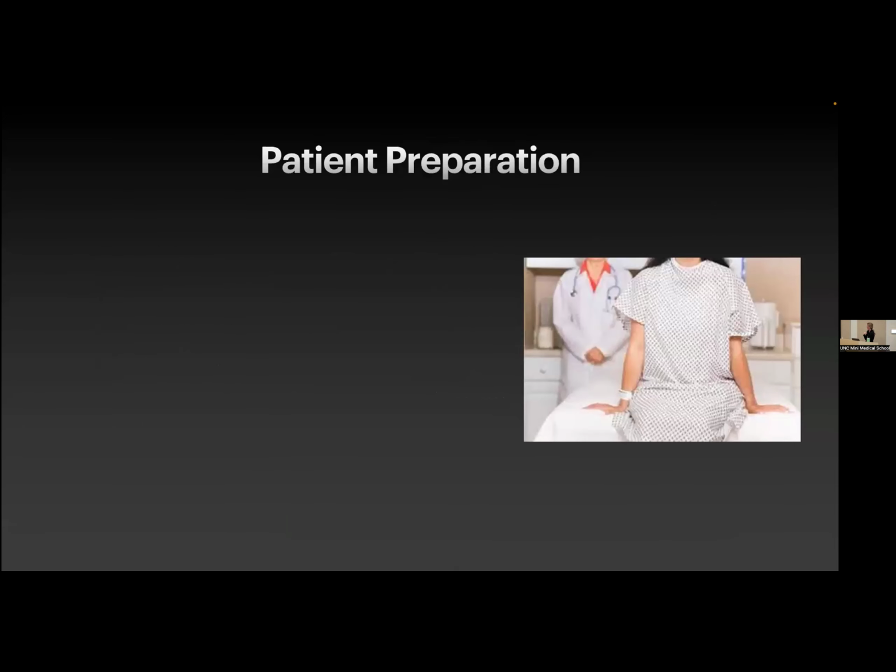So what do you expect as a patient if you're about to get an ultrasound? Well, the good thing is there's really little to no special preparation. There are some scenarios where you might be asked to prepare slightly for this exam. Typically, patients will come in and we'll have them in a gown, or even loose fitting clothing is fine. Scrubs work. The gel typically doesn't stain. We wipe it off right afterwards and you go on with your day.